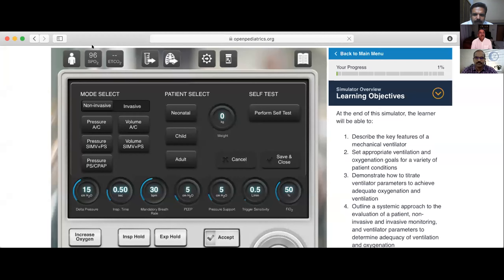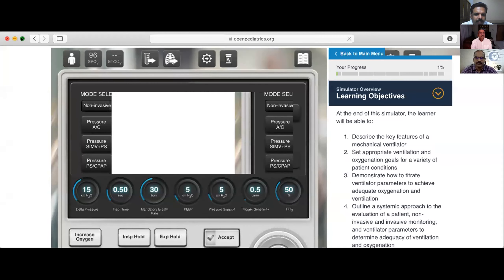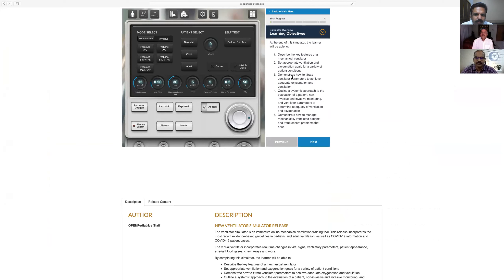Now it is visible — this is the simulator. All of you may be confused: whenever I touch the mode, this is how it opens. It will go one by one — only four modes will go one by one. I will teach all the modes in this simulator except SIMV.